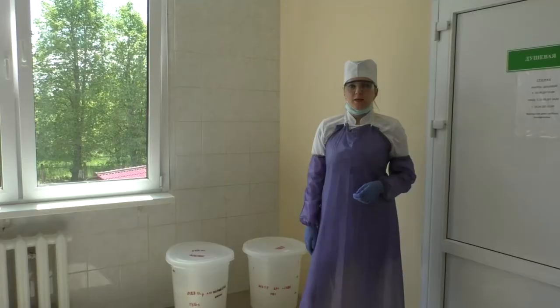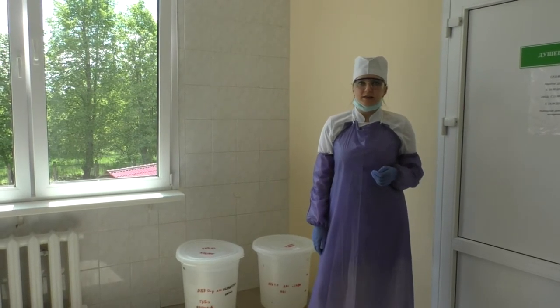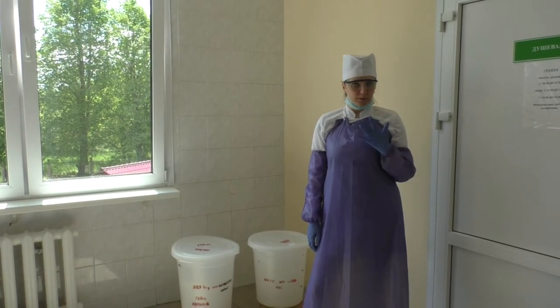Disinfection of the urinals and bedpan. Before disinfection, the nurse should prepare all personal protective equipment. You are working with a lab coat, cap, goggles, apron, gloves, and sleeve covers.